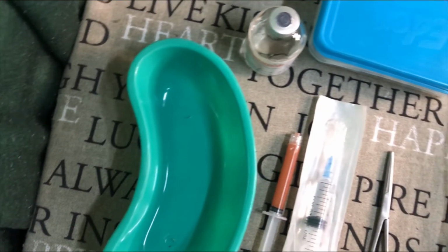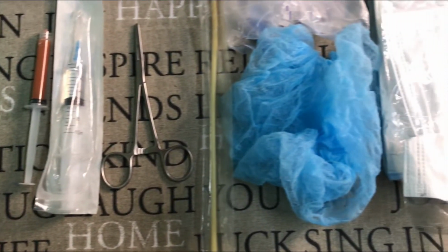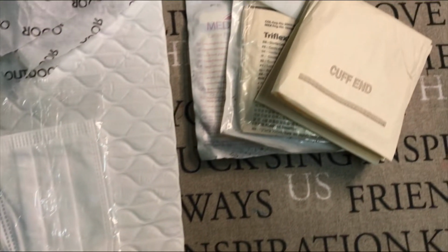Next is the gathering of the equipment that we are going to use. The rationale behind this is for us to save time and energy during the procedure. As you can see, some of the materials here are improvised materials only. After that, we provide some privacy. Providing privacy will ease her anxiety and make her feel comfortable during the procedure, and it will also preserve her dignity.